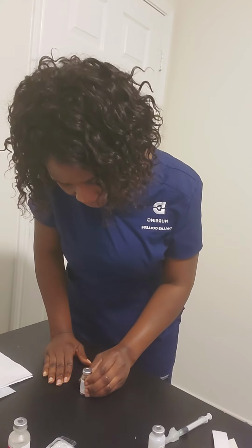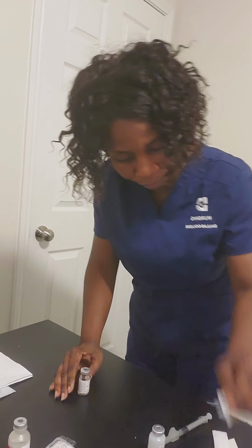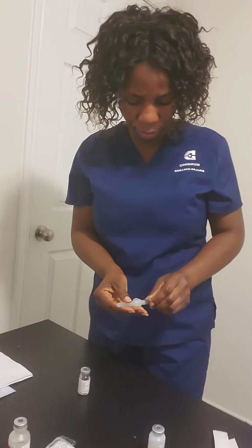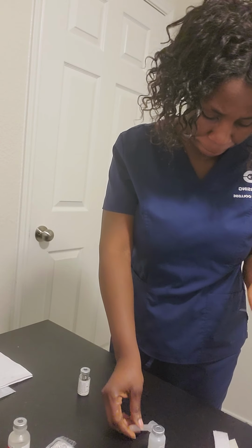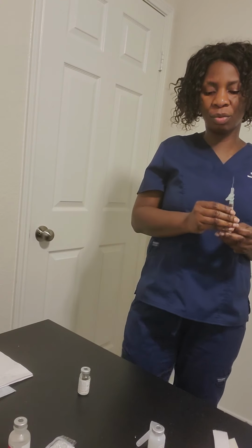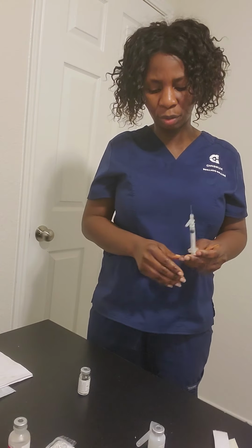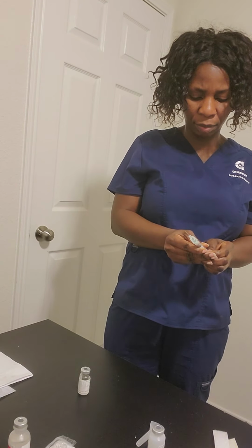I'm going to set the vial down, and I'm going to wipe again. Then I'm going to take off the cap of the needle, and I'm going to be drawing 2.5 ml of air into my ceftriaxone.